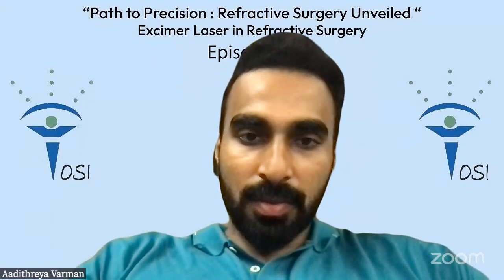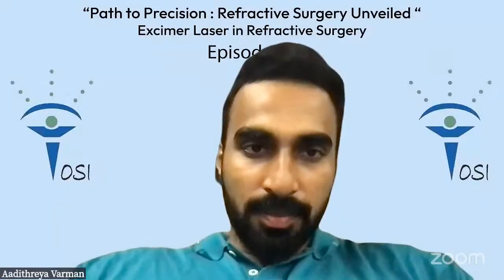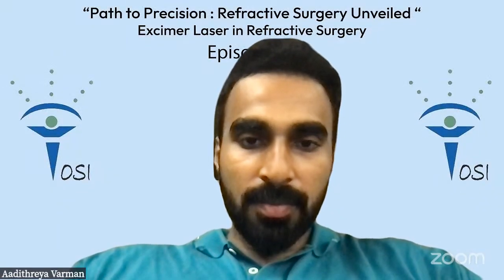And with the new companies coming up with differential energies, low energies next to each other, and spot size, I would say I'm using SILK for almost three years now. I don't dissect at all. I just grasp the lenticule. It's like your femtosecond ReLEx, already separated. You just have to take an instrument, go and catch it.